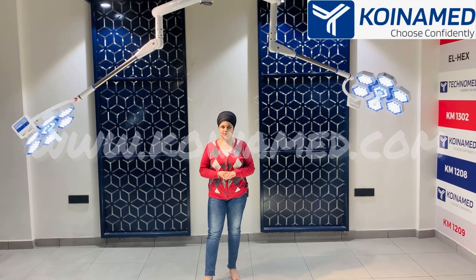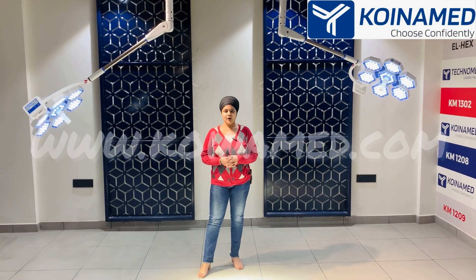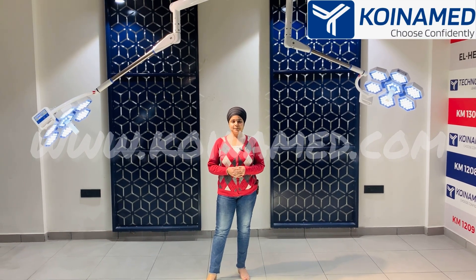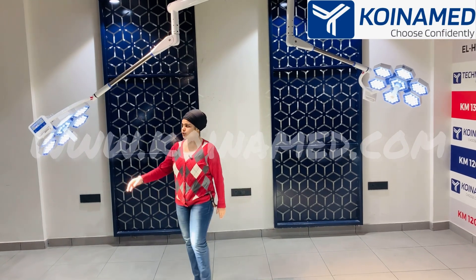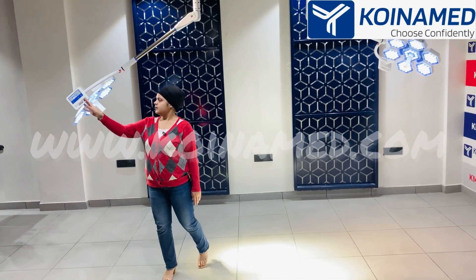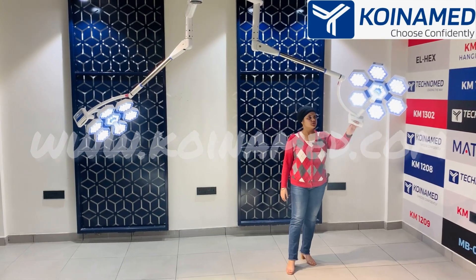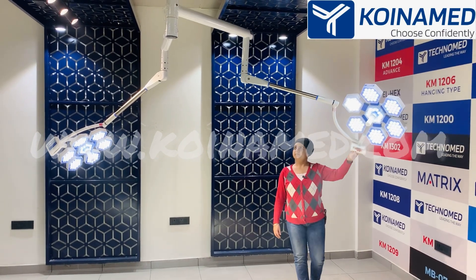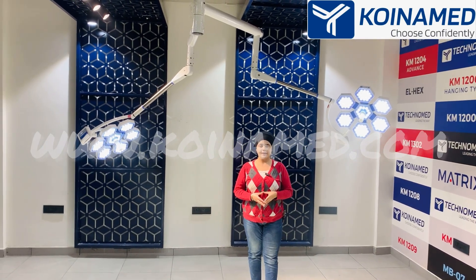As we are the manufacturer, we can do customization for you. Optional features you can add include a wireless wall controller, 360-degree rotation, and battery backup. In the double dome, the arms are swivel-mounted so you can rotate and adjust them to position the light over your operation bed. If you opt for 360 rotation, the arm will make a complete circle.